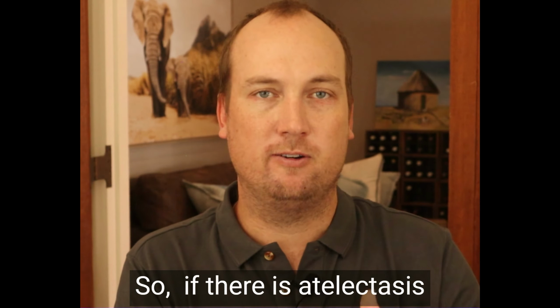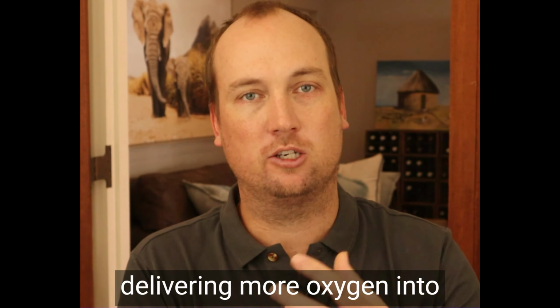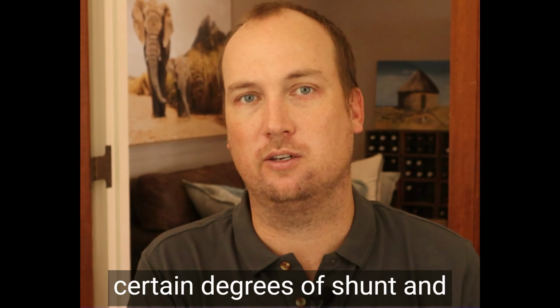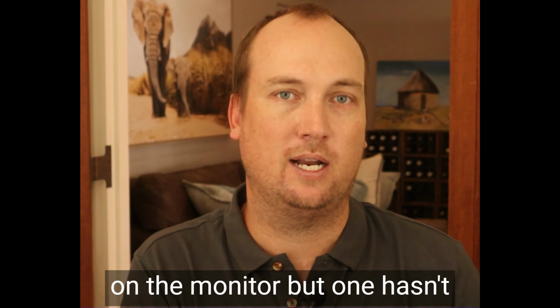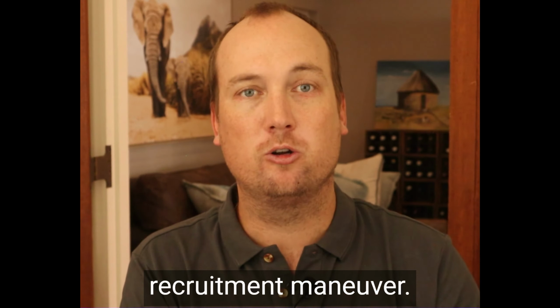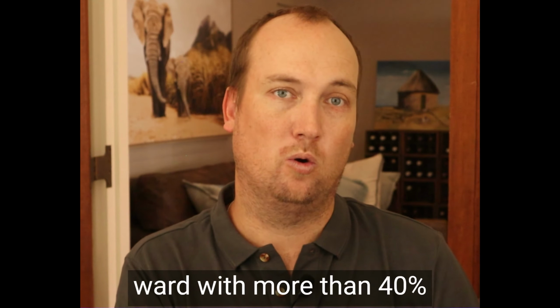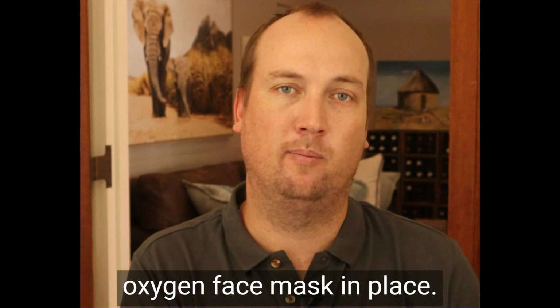So if there is atelectasis, there will be shunt, and so by delivering more oxygen into the lungs, one can overcome certain degrees of shunt, and then the picture might look better on the monitor, but one hasn't actually corrected the problem. So in those situations, one really wants to do recruitment maneuvers, and I certainly try not to send anyone to the ward with more than 40% oxygen face mask in place.